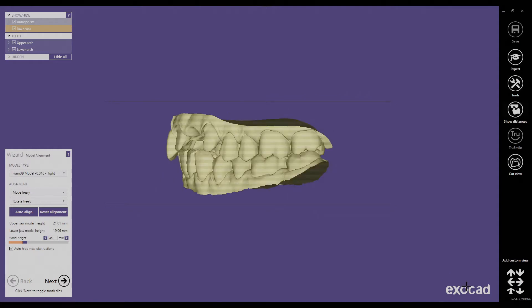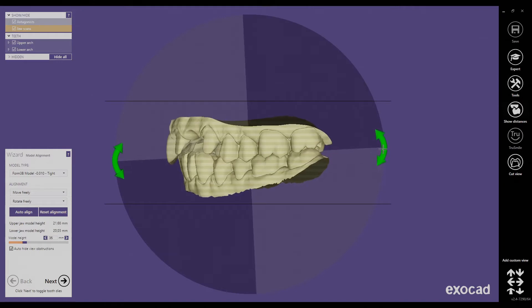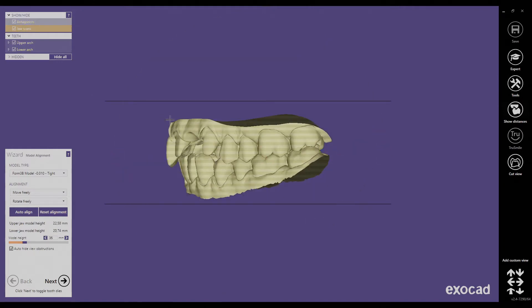One important thing to keep in mind is that we are doing a model with removal dies, so there will be dies in sockets in the model, and we want them to be as perpendicular to the model base as possible. Looking at the anterior region, if we had a perpendicular die body it would intersect with the gingiva, leading to a minimum wall thickness of the die socket and problems with die fit. A quick fix is to control-click on both models and angle them a little bit to create more room.